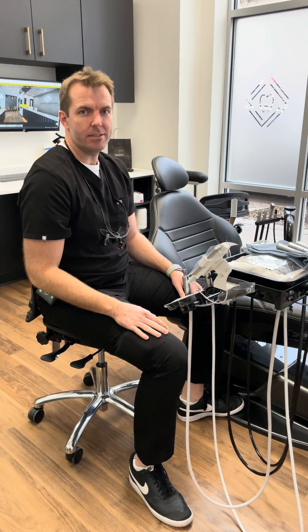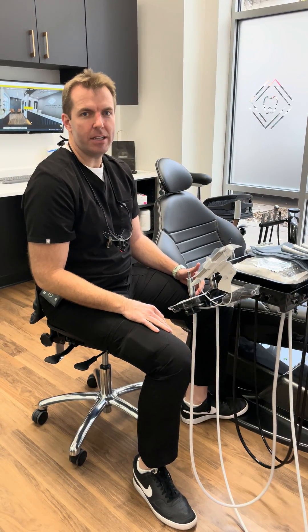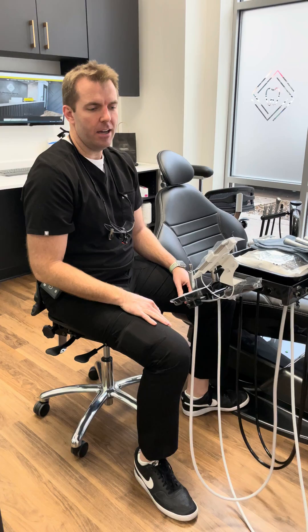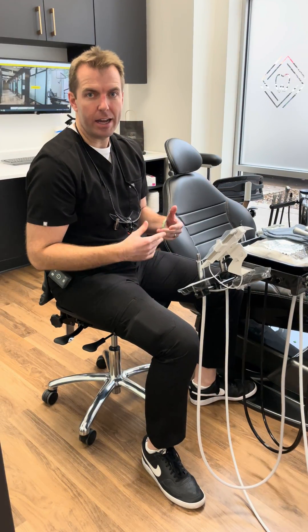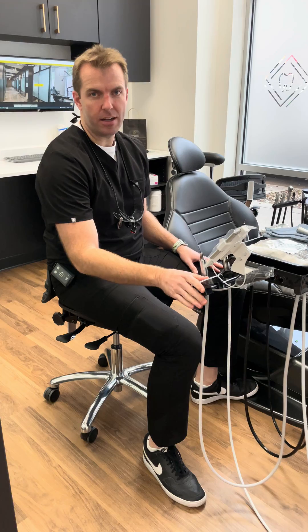Hey everybody, this is Gary Paulsis, owner of Lincoln Dental Lounge in Chicago, Illinois. I wanted to talk to you today about the Viet Air iOptima handpiece system that I got for my office.